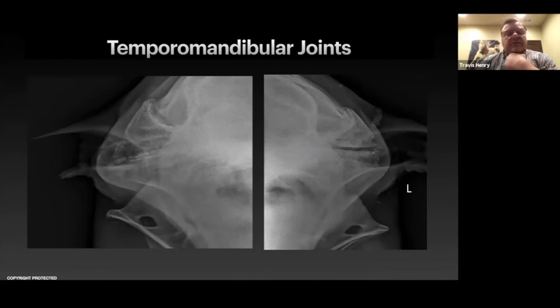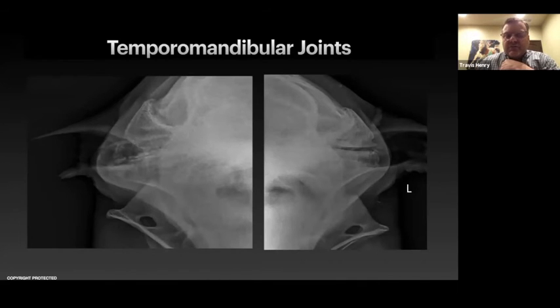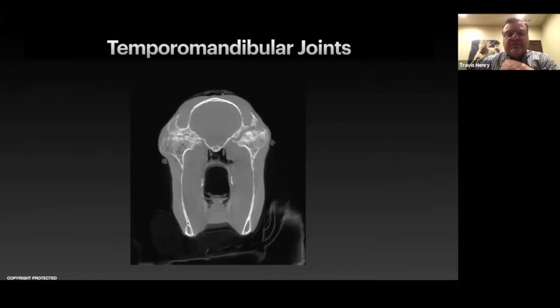This is another one that I don't think would respond to mandibular head osteotomy. This is the horse we showed before with compression in the guttural pouches. You can see that we have barely any type of joint space here. We have some joint space over here, and this is a dorsal to ventral projection, seeing all the proliferation that's happening here. But in these views, I wasn't as appreciative of the amount of disease process that was going on until we performed the CT. We can see here that this is all a lot of production on top of where the normal joint space should have been, and it's all moved up here with thinning of the petrous temporal bone. Here we have thickening of the petrous temporal bone, a lot of proliferation to the mandibular head.